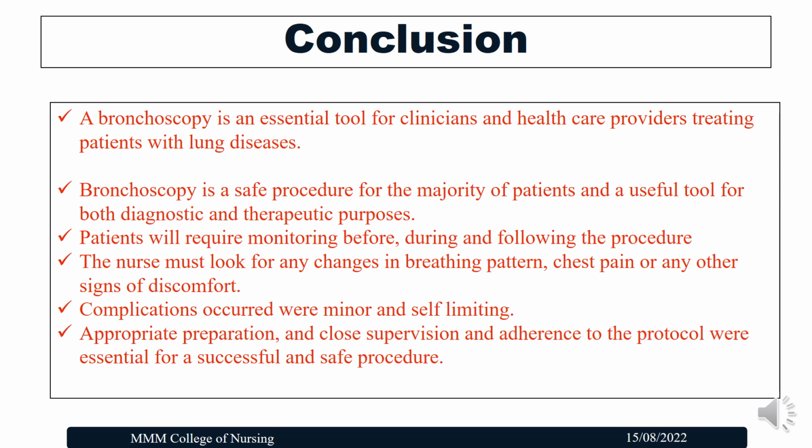To conclude, bronchoscopy is an essential tool for clinicians and healthcare providers treating patients with lung disease. It is a procedure where we can identify any abnormalities related to the respiratory tract. It is a safe procedure for the majority of patients and a useful tool for both diagnostic and therapeutic purposes. The patient will require constant monitoring before, during and after the procedure. The nurse must look for any changes in the breathing pattern, chest pain or any other signs of discomfort.